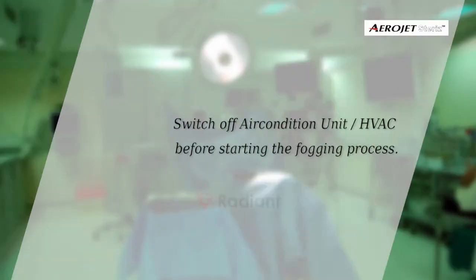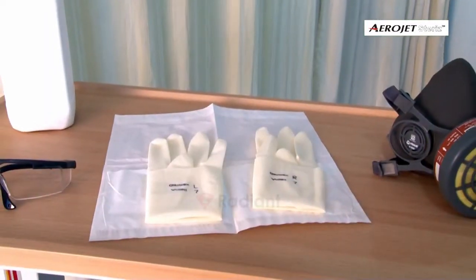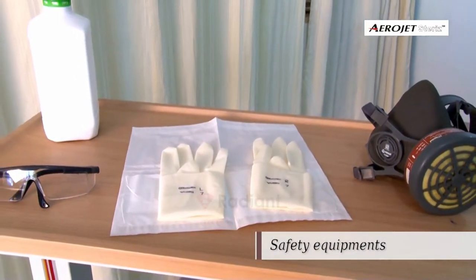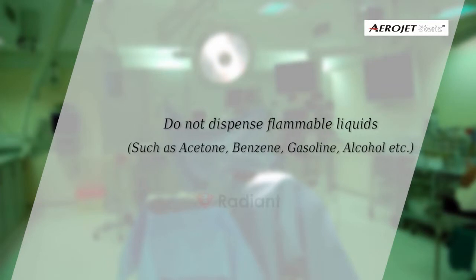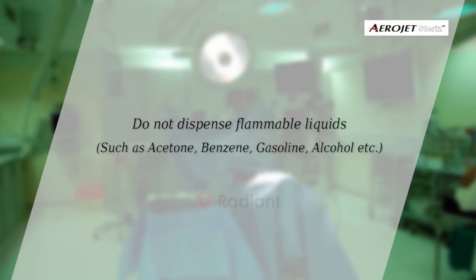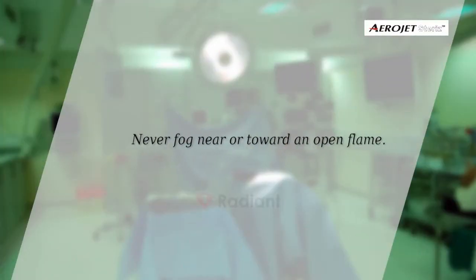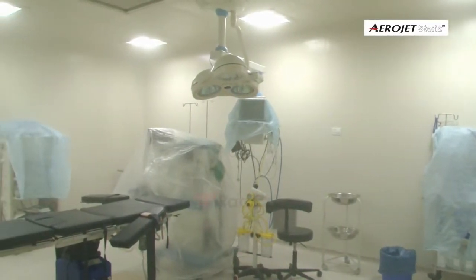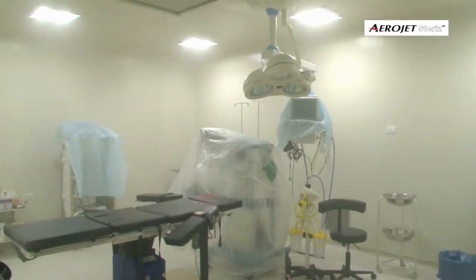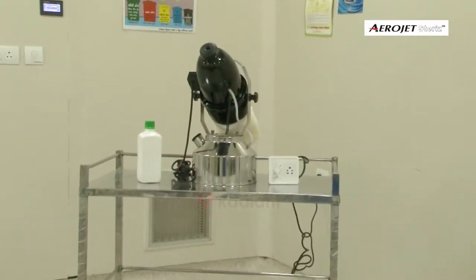Always switch off the air conditioning unit before starting the process. Use necessary safety equipment as recommended by the disinfectant label. Do not dispense flammable liquids such as acetone, benzene, gasoline, or alcohol. Never fog near or toward an open flame. Cover electronic equipment with linen or plastic cover.